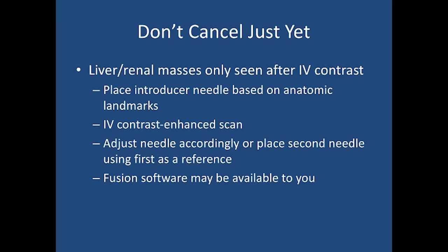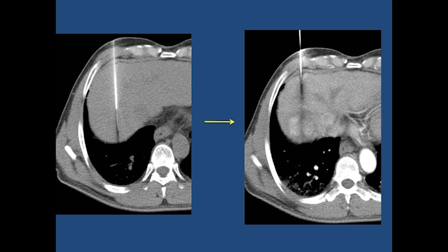In some practices, however, fusion software is available, in which case a preliminary or prior CT or MR can be fused with intraprocedural imaging, such as ultrasound imaging, in order to increase the chance of getting into the lesion itself.